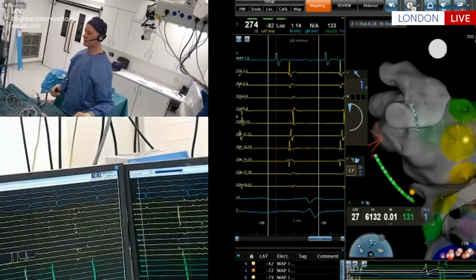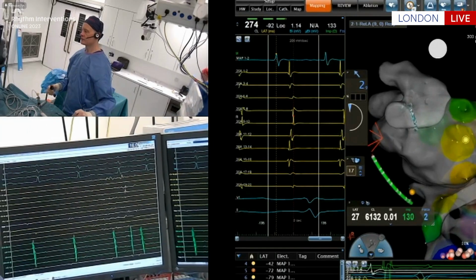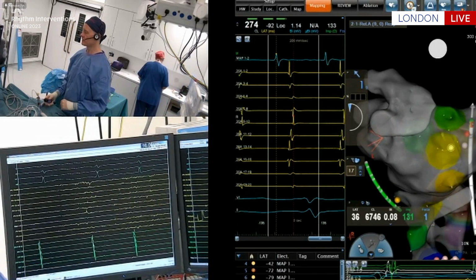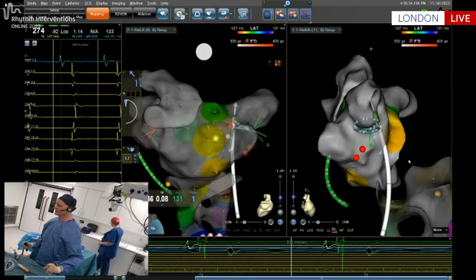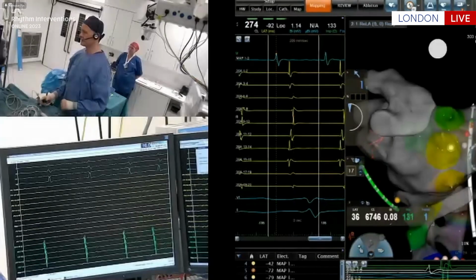This is the left lower. And again, nothing there. Switching over to the right upper. That's all clear. And then I'll just slowly drag it back to make sure I'm not too far in. And it's clear all the way back. And then right lower again is all clear.